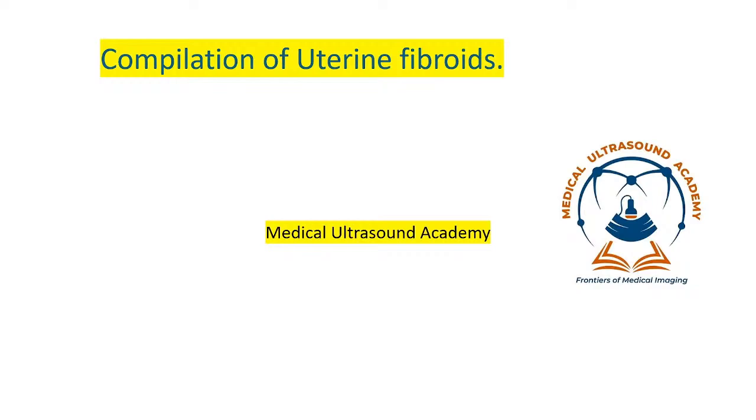Hello everyone and welcome. So I feel the best way of learning is to repeat. Repetition is the best way of learning. So in this presentation, I am going to give a compilation of different or various uterine pathologies.